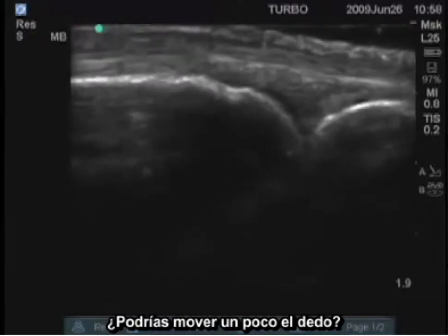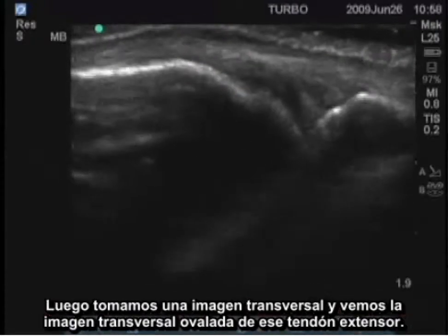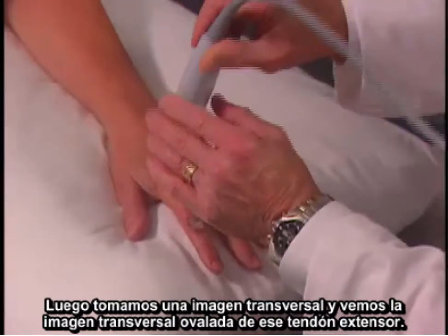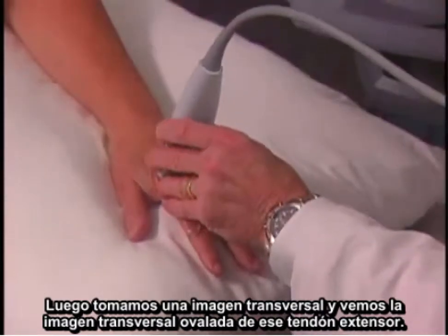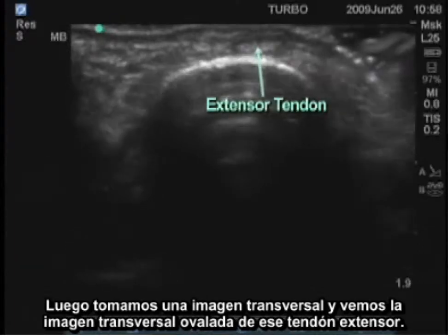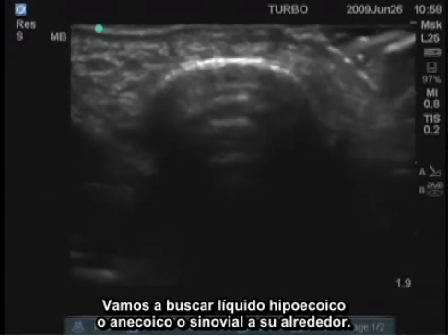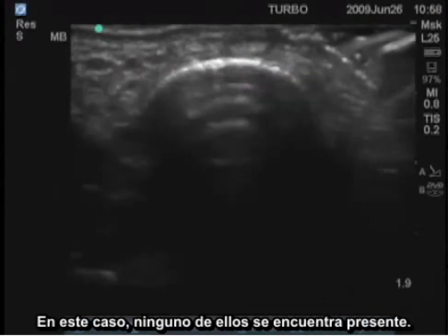You can see that tendon moving and the joint moving. We'll then take a transverse image and see a transverse oval image of that extensor tendon. We're going to look for hypoechoic or anechoic fluid or synovium around it — in this case, none of that is present.